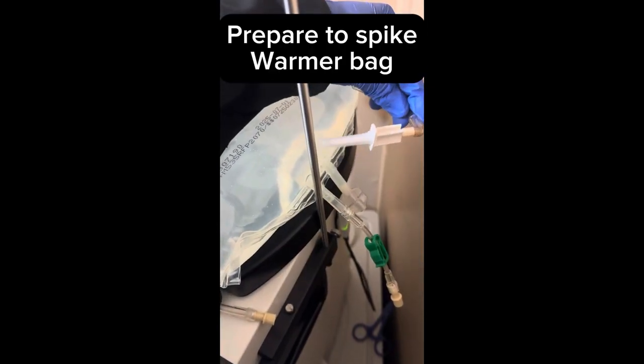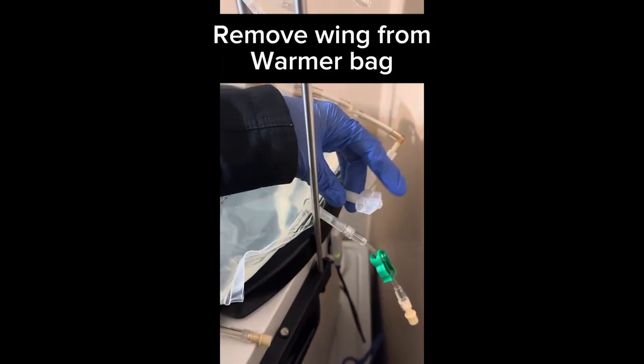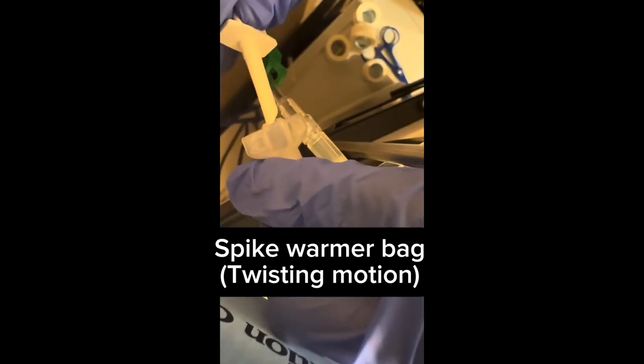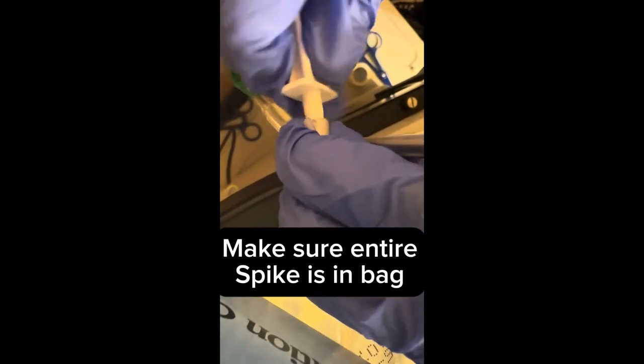Prepare to spike the warmer bag. Remove the wing from the warmer bag and remove the cap from the spike. Spike the warmer bag using a twisting motion and make sure the entire spike is in the bag.